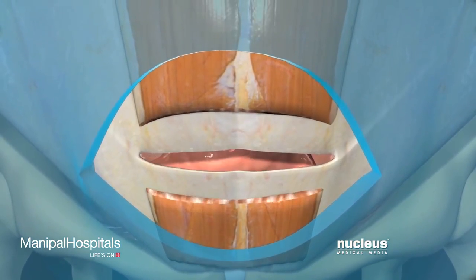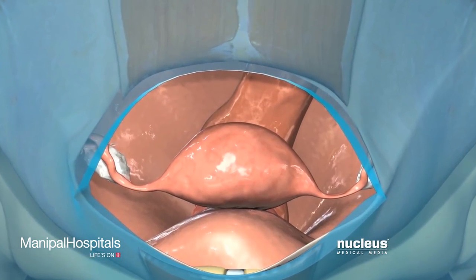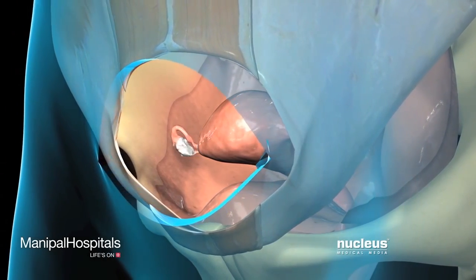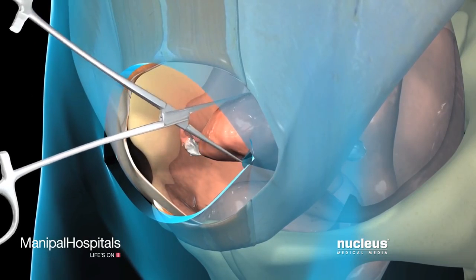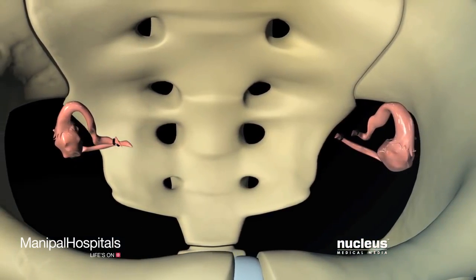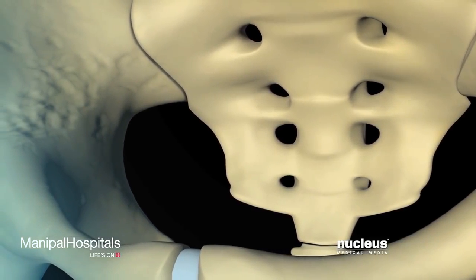Pull back the muscles to expose the uterus. Cut the ligaments and tissues holding the uterus in place, and remove the uterus through the abdominal incision. If your procedure includes a salpingo-oophorectomy, your surgeon will remove the ovaries and fallopian tubes in the same manner.